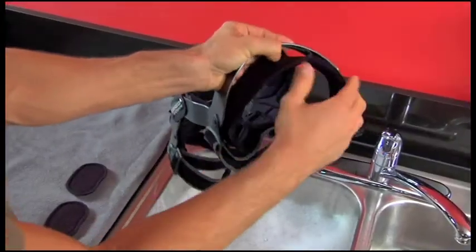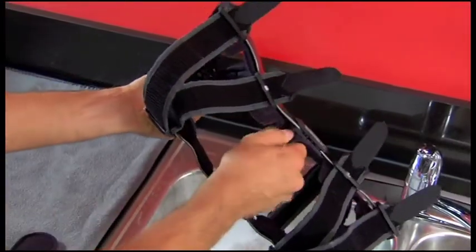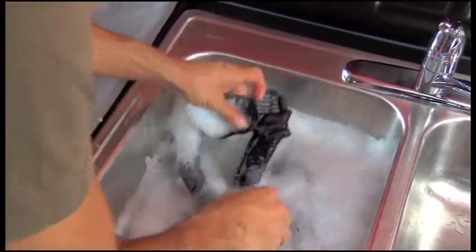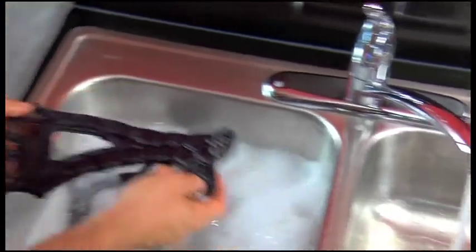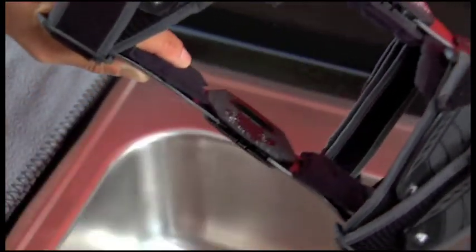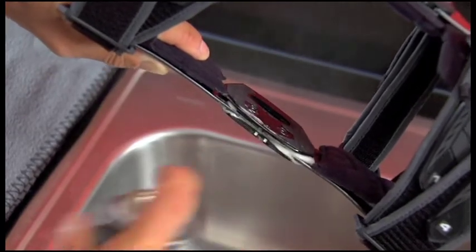You'll need to clean your LPR brace regularly depending on how active you are and how much you perspire. To clean your brace, remove the frame pads, condyle pads, and straps. Hand wash brace parts in cold water with mild soap, then rinse and air dry. Occasionally you may want to apply a dry lubricant to the hinge, especially if you've worn your brace in water. Don't use WD-40 or other solvent based products, oil, or grease, since they can attract dirt to the hinge.